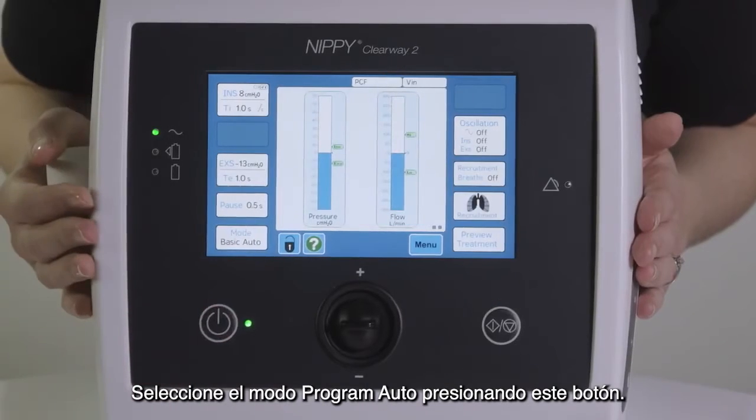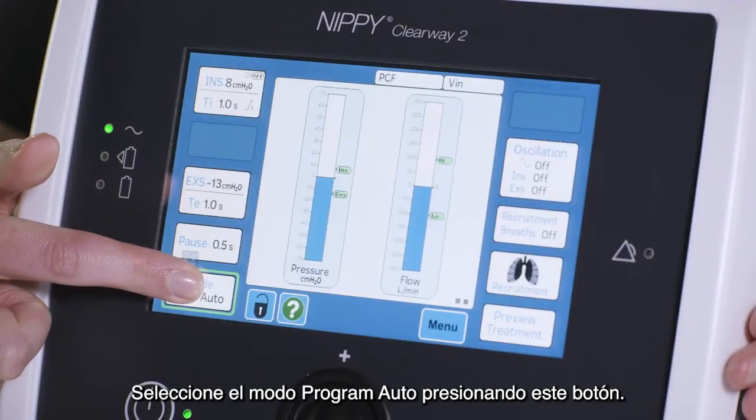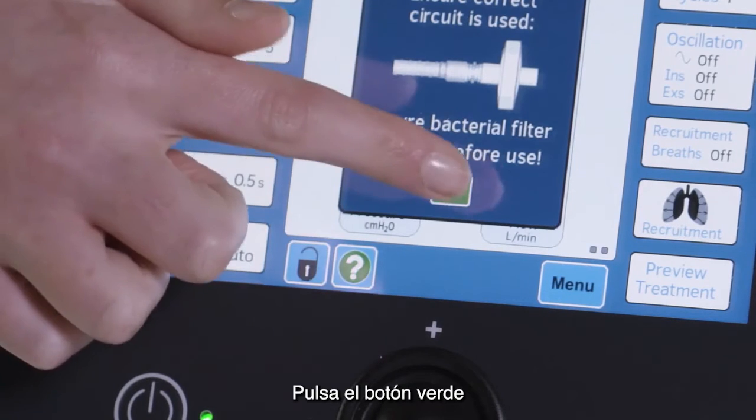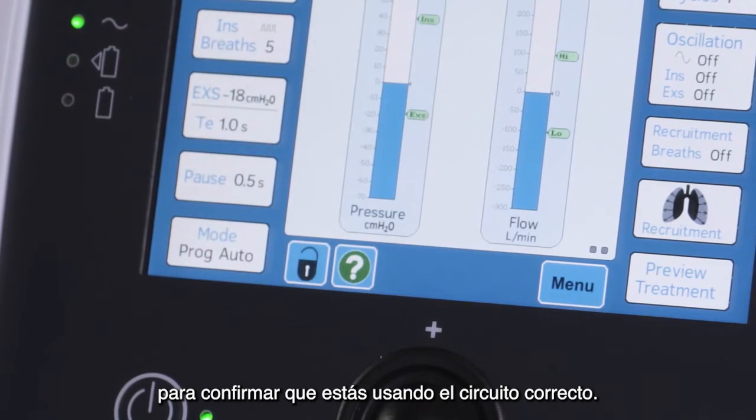Let's select the program auto mode by pressing this button. Press the green check button to confirm you are using the correct circuit type.